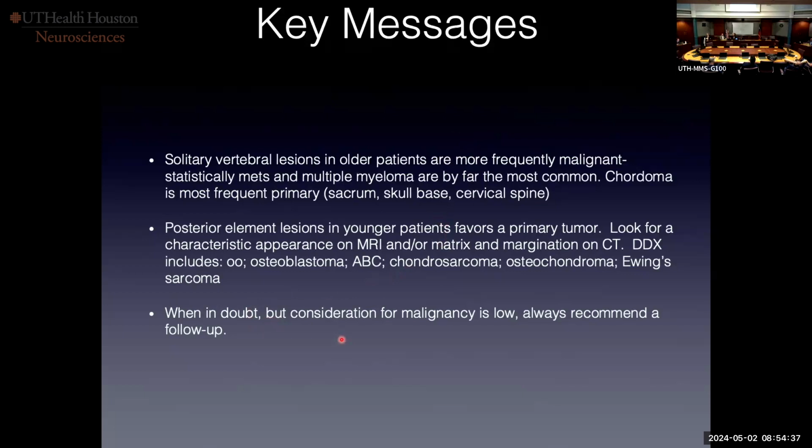FDG PET, if it's an atypical lesion and you don't want to follow this and later be proven that it is something more serious, having at least a negative FDG PET might make you feel better. So I think that's about all. I want to leave time for a few questions. Any questions?